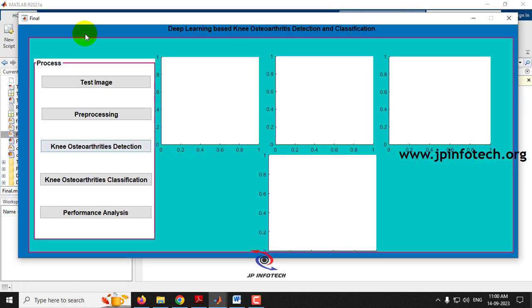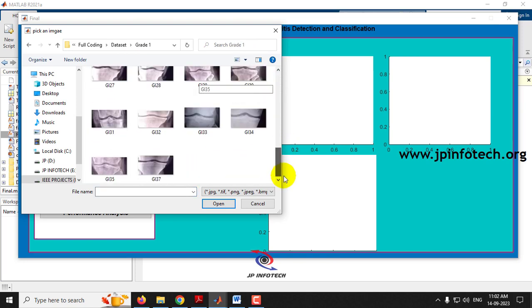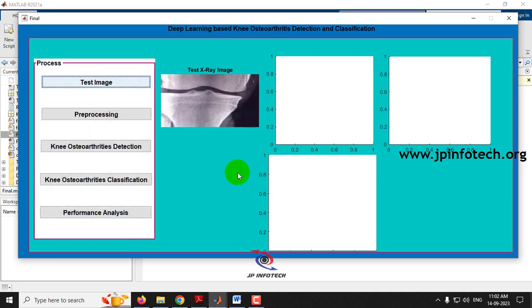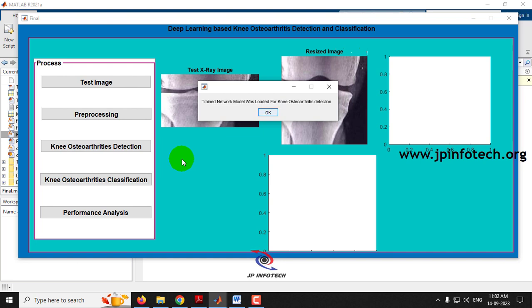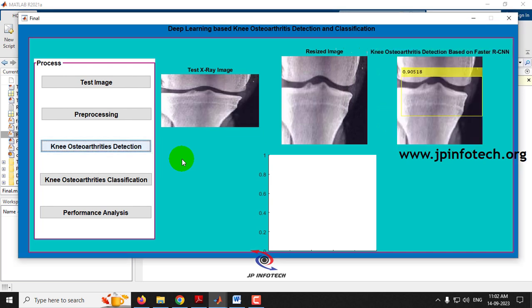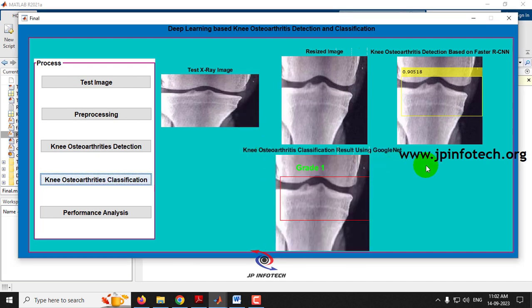Now let me demonstrate with the dataset images. Let me go to the dataset folder and select grade 1. I'll select an image, click pre-processing to see the resized image, then click the detection part. Now you can see the Faster RCNN has detected the knee osteoarthritis with its score. Going to the classification part, the GoogleNet architecture has classified the knee osteoarthritis as grade 1.